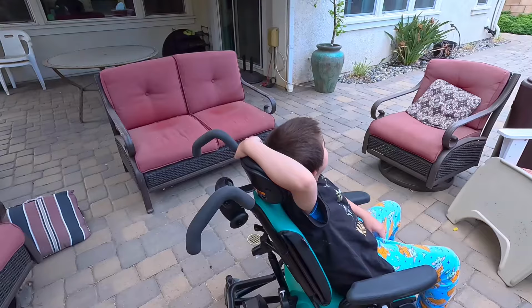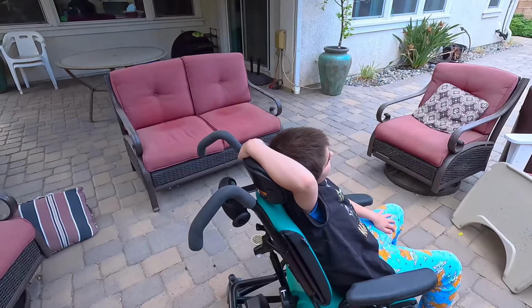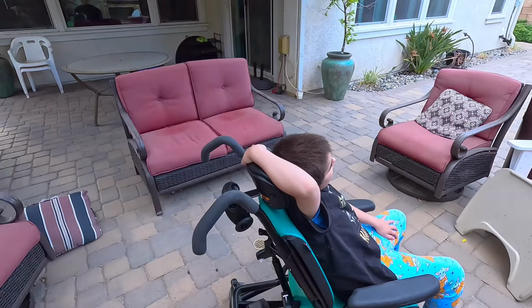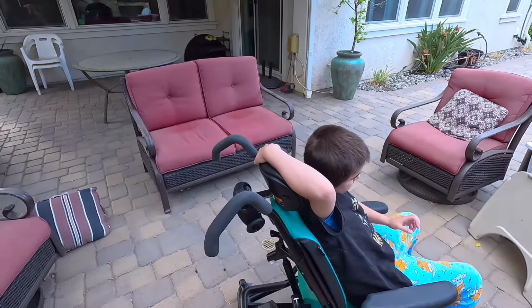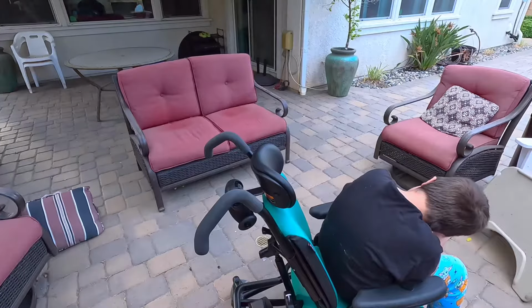The wheels are designed to roll pretty freely, so anytime that he's in the chair, it's best to lock it down and keep it locked down so it doesn't roll away or anything. It wouldn't roll on a level area though. And again, just always confirm that the caster brakes are applied prior to transferring Billy in or out of the chair.